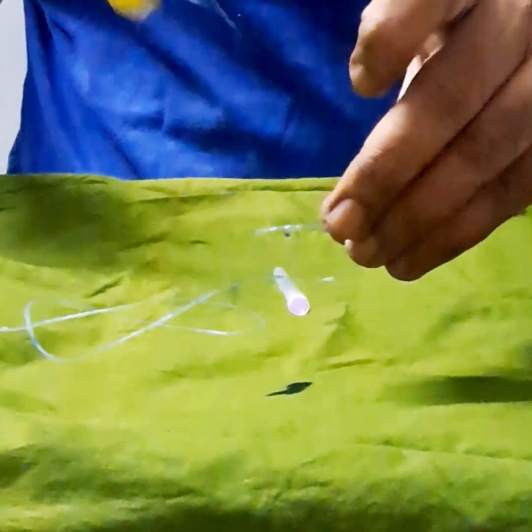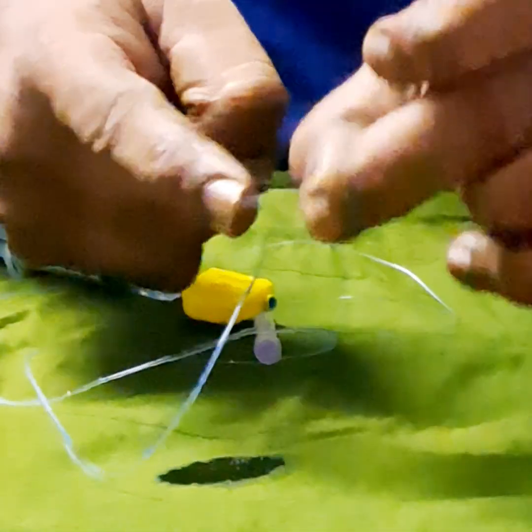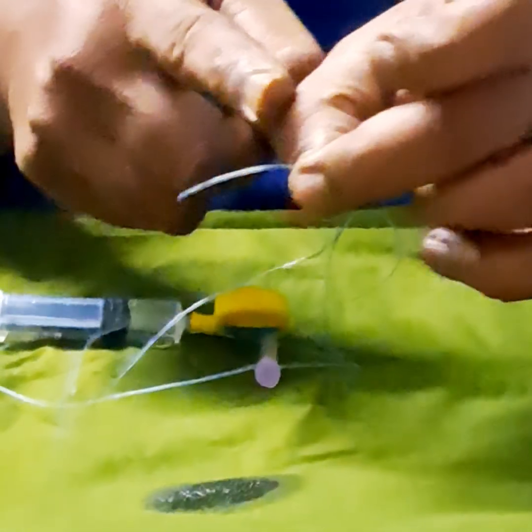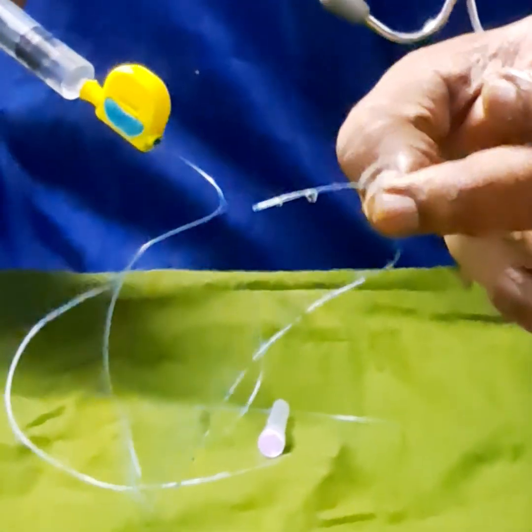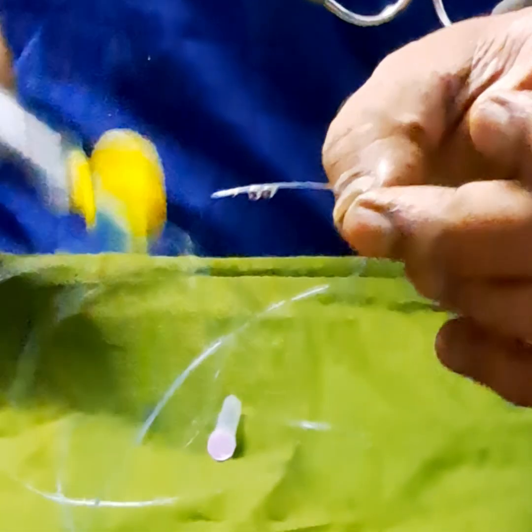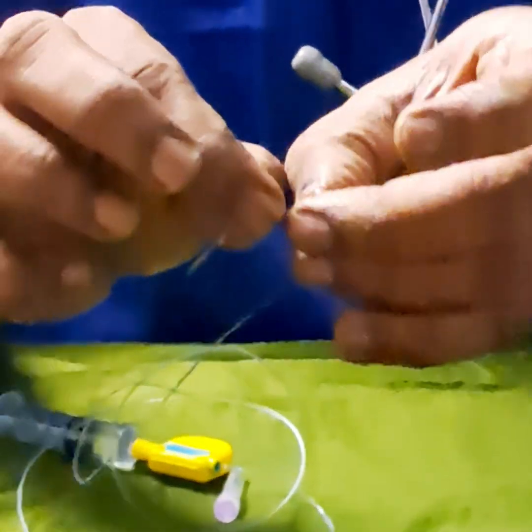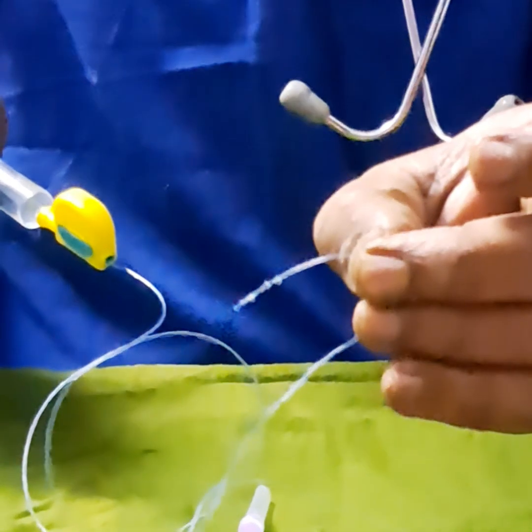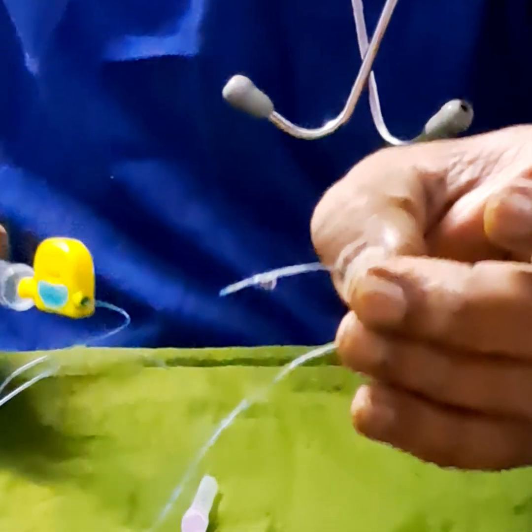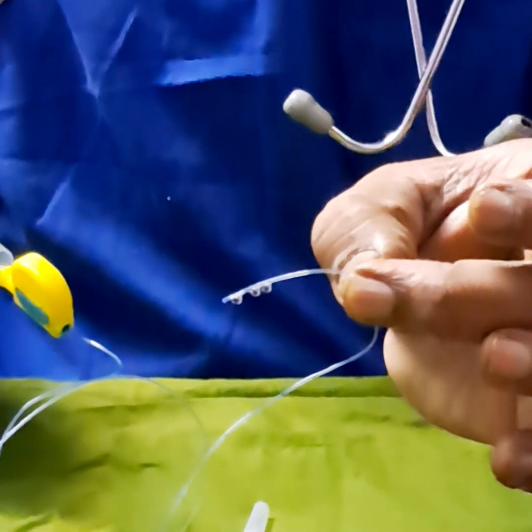There are 3 lumens in this catheter: 1, 2, 3. The distance between them is a maximum of 1.5 centimeters. Now if you insert the catheter 3 centimeters inside the epidural space, see the proximal lumen — the proximal lumen is well inside the epidural space. You don't need to push the catheter a great distance. All 3 lumens are well inside the epidural space.